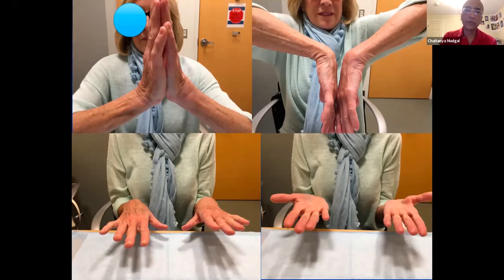So that's pretty much what we did. She was splinted for about three weeks before we started ranging her. This is her at about three months, and I've seen her at about a year — her function is practically symmetrical to the other side.